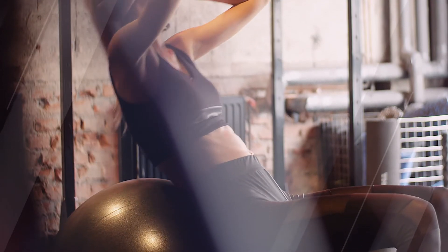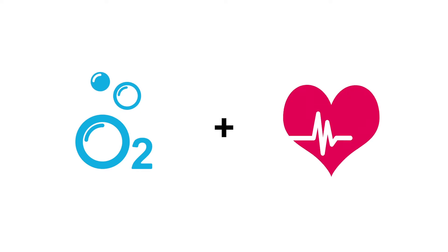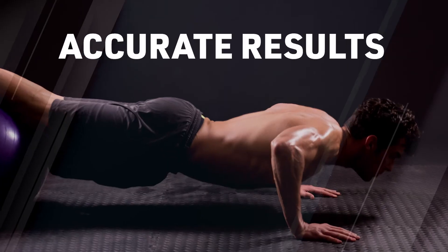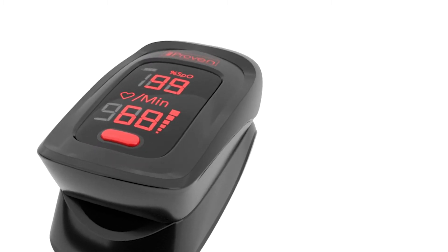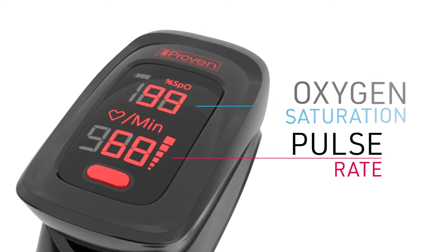The fingertip pulse oximeter offers a great way to gain insight into your health and fitness. By showing the level of oxygen in your blood and pulse rate, it will be much easier to focus on your specific health goal and reach a healthy lifestyle. This video will explain how to use the oximeter for the most accurate results so that you can live your healthiest life. The oximeter is a digital device intended to non-invasively monitor the oxygen saturation and pulse rate at home.